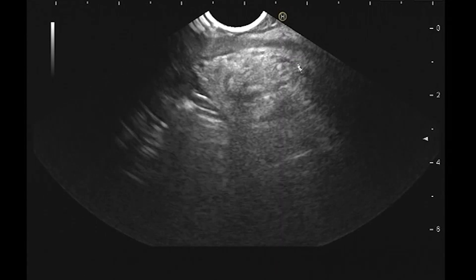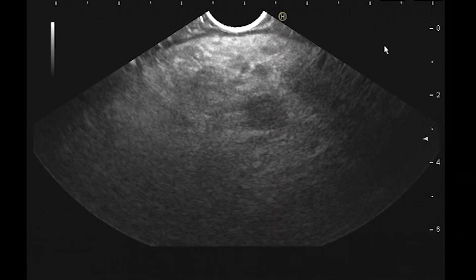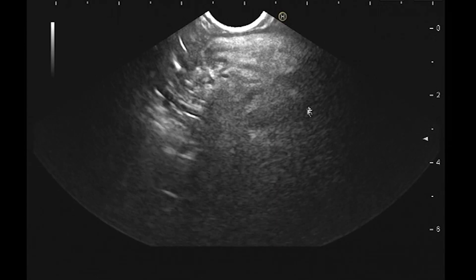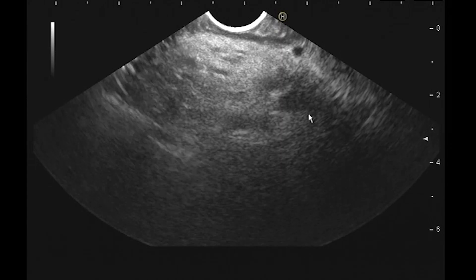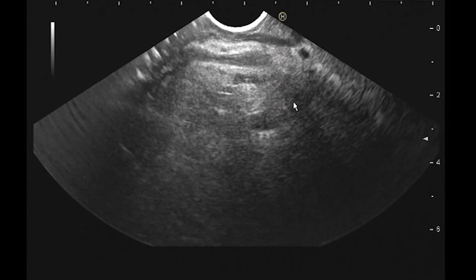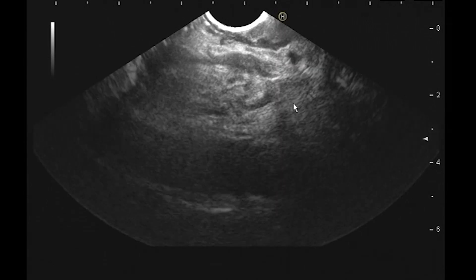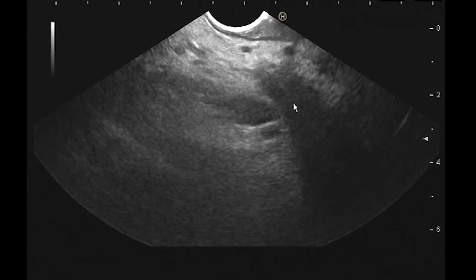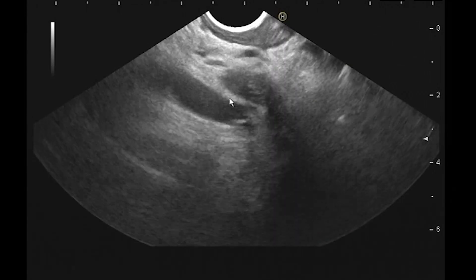As I come across the genu here, we're going to see the transition — we're going to start seeing this lesion. You can see the SMV here, which sort of disappears into this lesion. The lesion is right in the neck. It's kind of a genu lesion. So there is definitely a transition zone — it becomes totally abnormal right here.